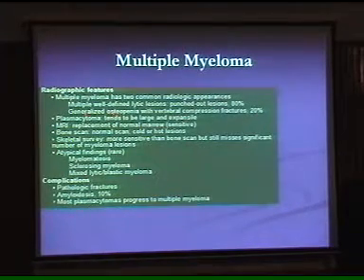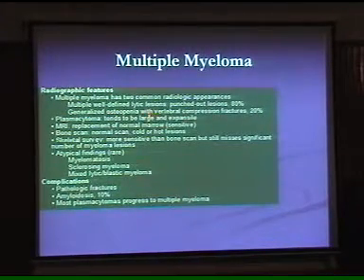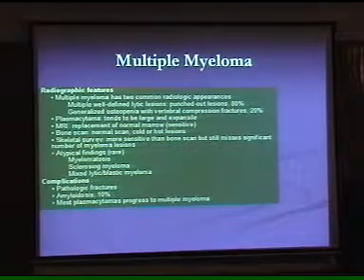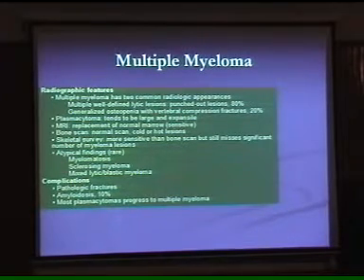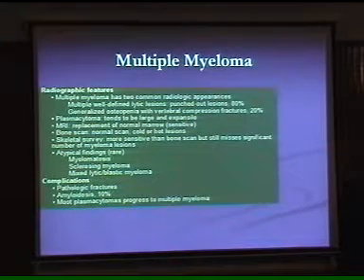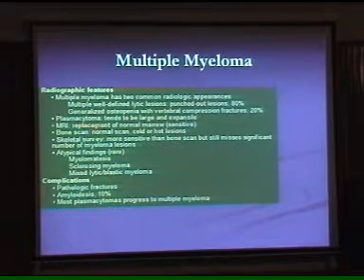I'll show you one of the slides. Generalized osteopenia with vertebral compression fracture. Fractures are not because of anything, but because of decreased bone matrix, decreased bone quality and volume. The bones become very fragile, with the result they may fracture without any trauma, by simply doing your movements. In old people, they break down.